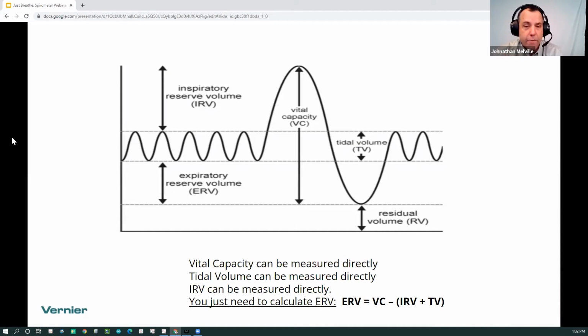What's really interesting is if you were to do a breath hold, which is another experiment that we do. Let's say you were doing a breath hold. So you have the students breathe normally, breathe normally, breathe normally, and then hold their breath for as long as they can. Right. And then start breathing again. What you would wind up seeing is recovery breaths. So you'll see that tidal volume gets much, much bigger as you're recovering, and then it gets normal. It's really just to see that after you do a big inhale and exhale, you do recover.